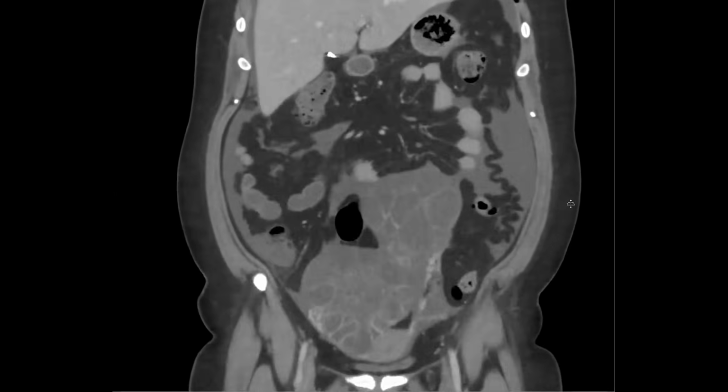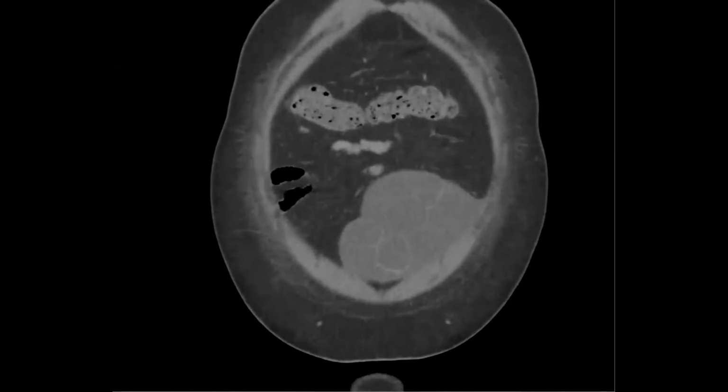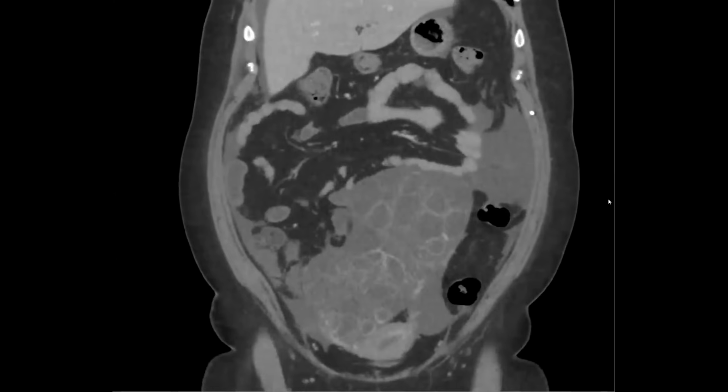How do they find the egg? And is it done under imaging guidance? Yes. When you do egg freezing, egg harvesting in any way, they basically do transvaginal ultrasound. And then they usually have a guide. They put the transvaginal ultrasound right on your ovary and then put the needle straight into each follicle and then try to grab the little egg out of the follicle. So the egg is visible under transvaginal ultrasound?